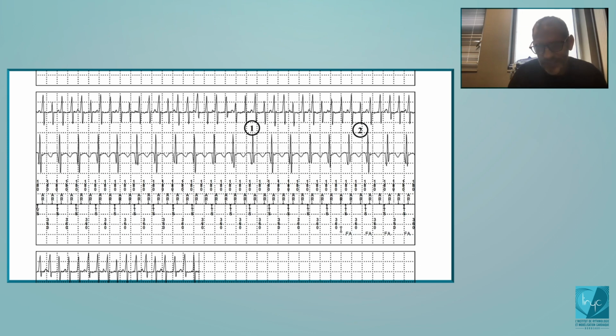And for example, here, all the intervals are 360, okay? And he will sum the two more frequent intervals. Let's say you have an alternance between 360, 350, 360, 350. So if you sum 360 and 350, you will have 100% of cycles in these two, okay? And this is going to be considered as stable.